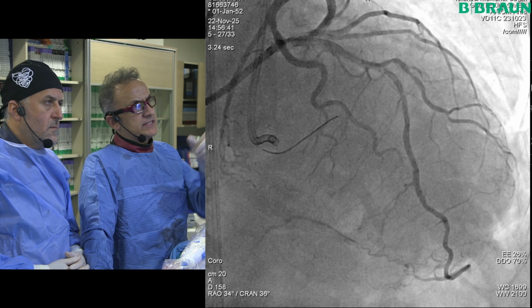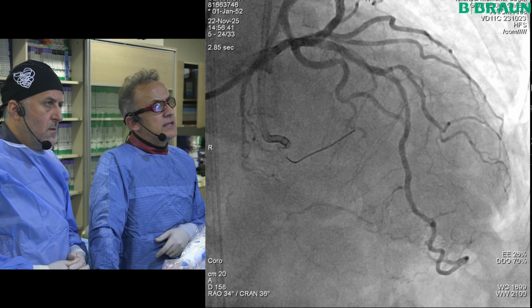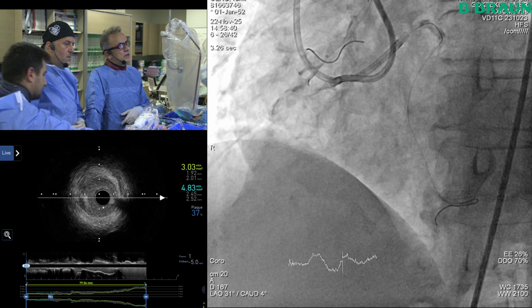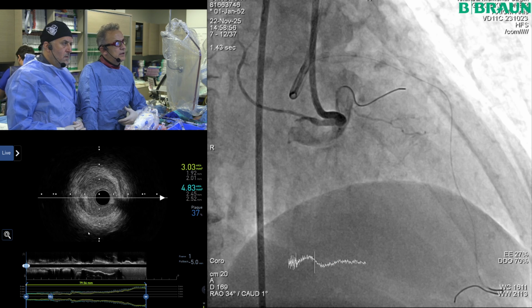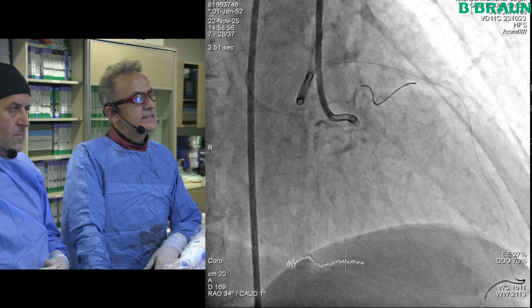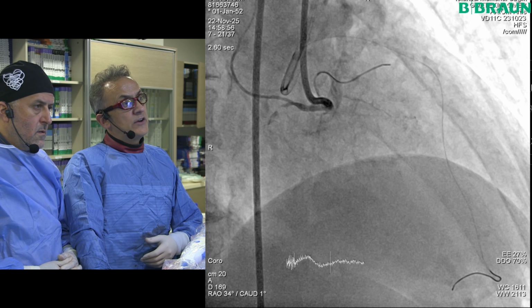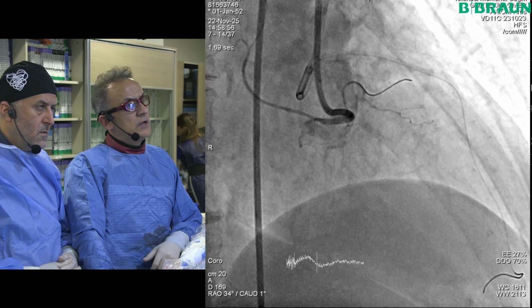Here we have a calcification, just at the carina, we have seen it. It's a calcified lesion. It's calcification, as you see. And since we have 10% ischemia, we plan to open this RCA. Although it doesn't look like that big an artery, CX is very good. RCA is only one branch actually, to be honest with you.